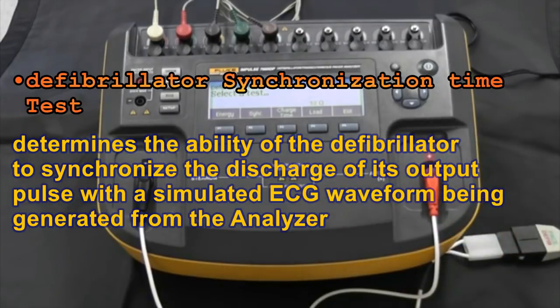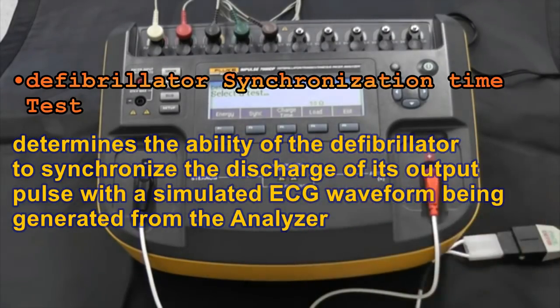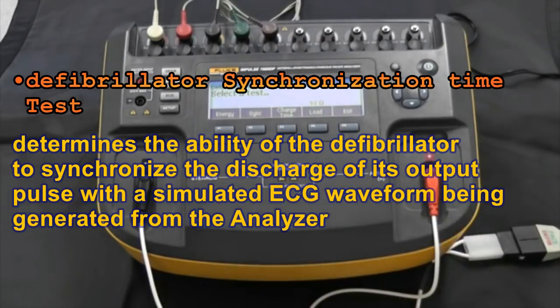Once we've selected defib as the category we want to test, we have different kinds of tests available: energy, synchronization time, and charge time tests. We can also select a load — if we have the 7010 external load accessory we could select our load there. Otherwise, as you see here, we're selecting the internal 50 ohm load.